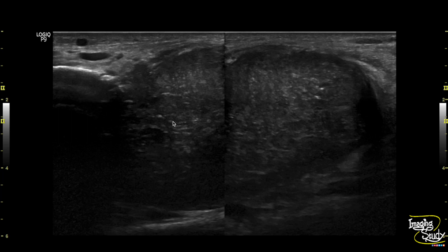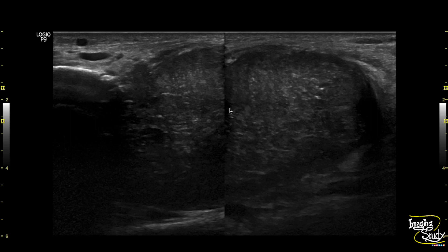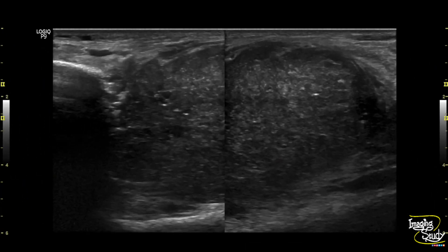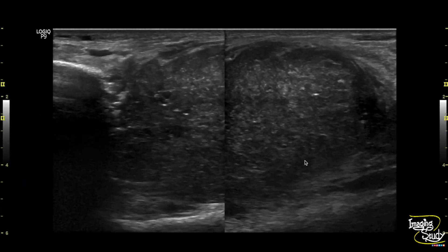Here is the picture of the lesion — you can see the tibial bone and the soft tissue mass causing destruction of the bone at that point. This is a heterogeneous lesion; you can see some hypoechoic linear areas indicating blood vessels, as confirmed by color Doppler. The lesion also shows some fragmented calcific foci as well as some cystic spaces of blood vessels.